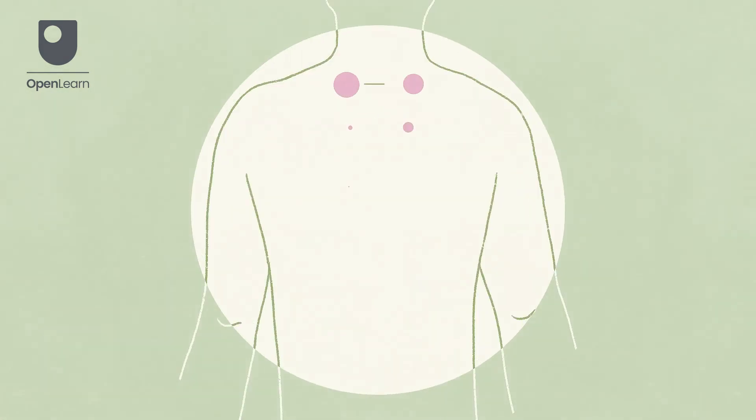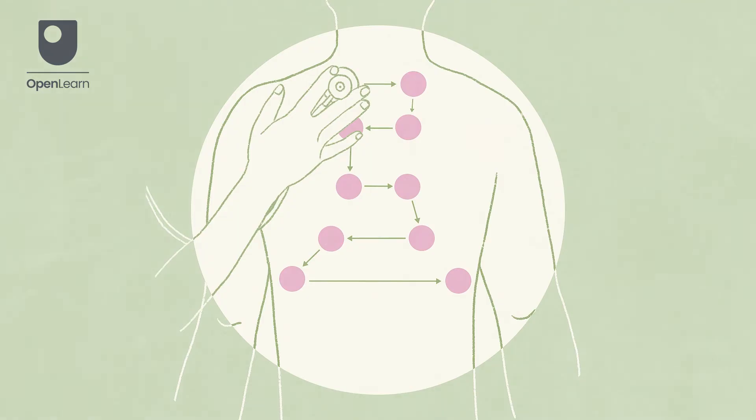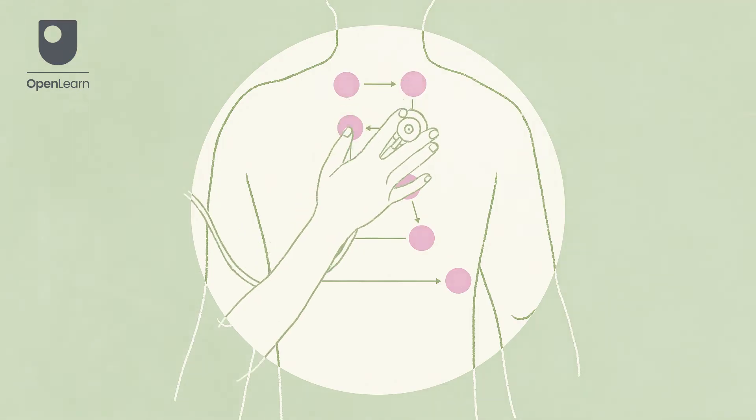Now repeat the process at the rear of the patient's chest. Place the diaphragm of the stethoscope on the left-hand side of the chest at the first intercostal space. Now use the stepladder approach to move your way down to the bottom of the chest.